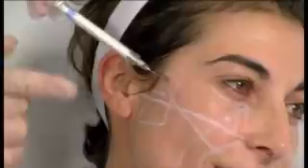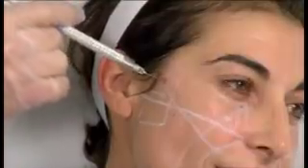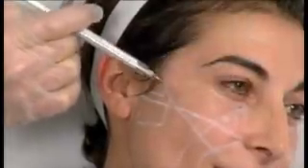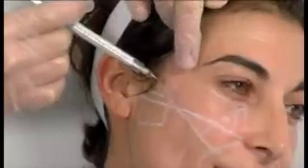Now, if you look at the direction of my cannula, you can notice that it is in the same direction as my alar tragal line, the line that I was talking about that is going to be your guide during the procedure. So I'm advancing the needle over the bone. Am I on the bone? Yes, I'm on the bone. I can feel it. And advancing the needle. This might be painful for some patients because the periosteum can be quite sensitive.